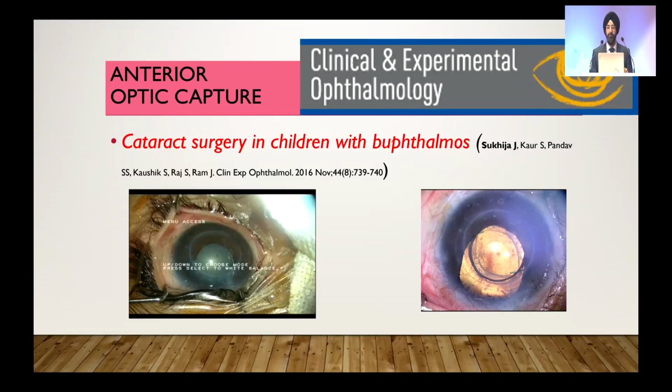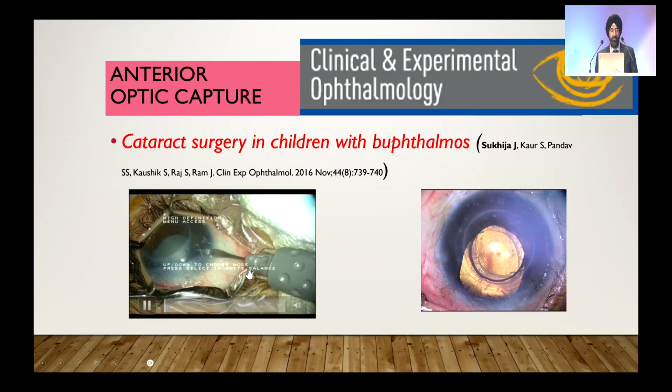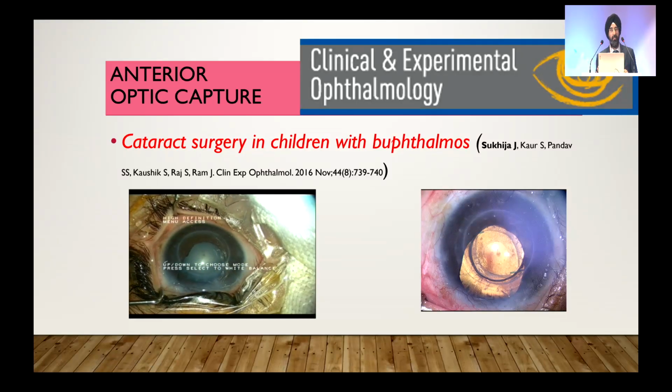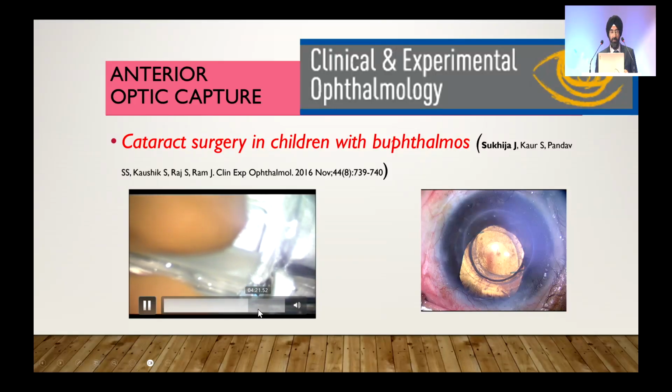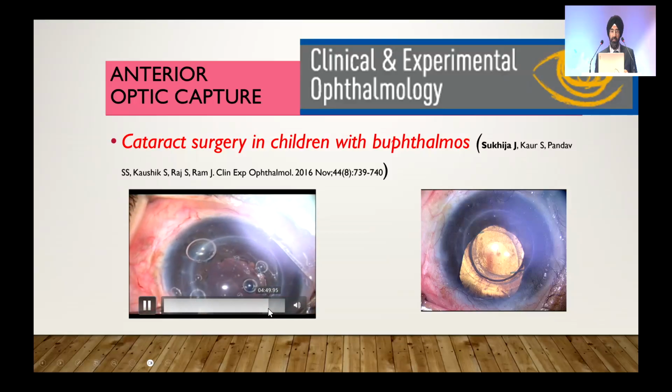The third thing is, especially in cases of buphthalmos, when you have those bags which are large, and you try to place an IOL in the bag, what really goes wrong is that with a posterior capsulotomy the IOL can just move about left and right, and you can have a decentered IOL. So in such cases, you can do an anterior capture. Anterior capture means the haptics are in the sulcus, and the optic goes in the bag, which has the posterior capsulotomy.